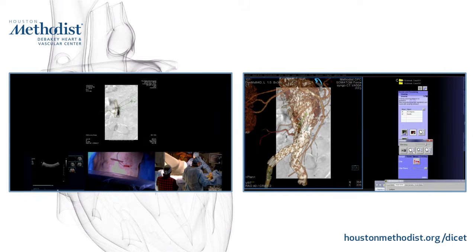So this is how we save our contrast and use it for our dynamic imaging upfront, so we can use it for guidance. And so I'll let this video play here. This is us shooting an angiogram and confirming our trajectory of the lumbar artery.